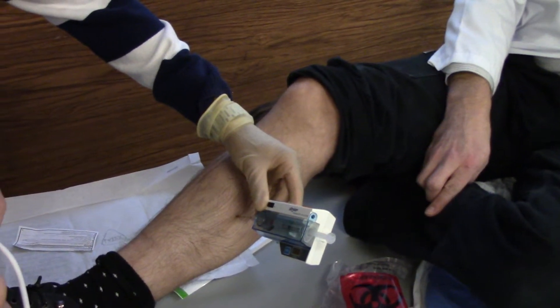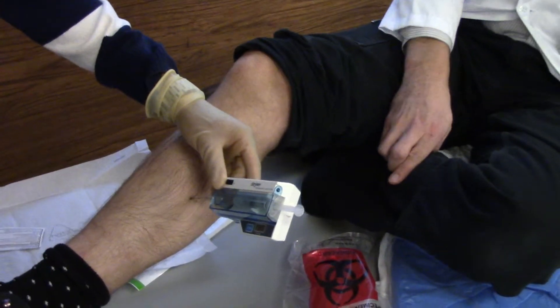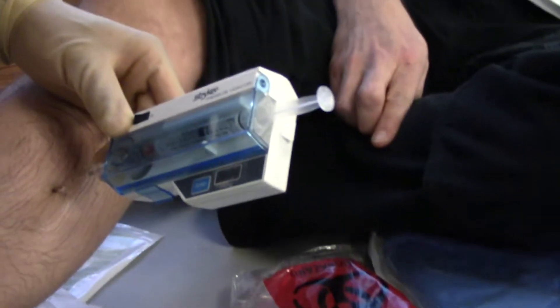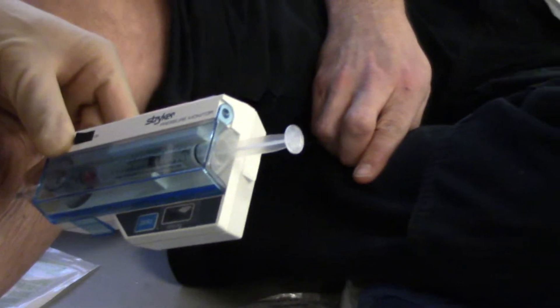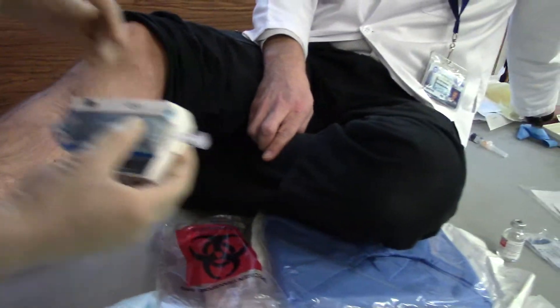If there's a staying high pressure within this compartment, it's really not going to equilibrate. It says eight. Good job filming. And that's it. Bravo. Bravo to you. Thank you.